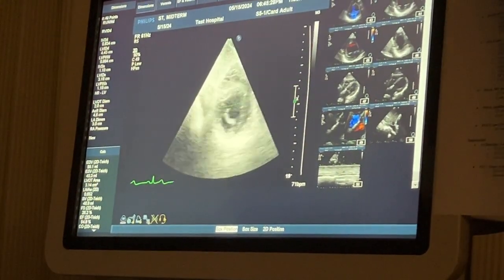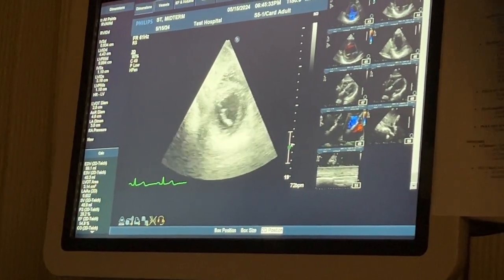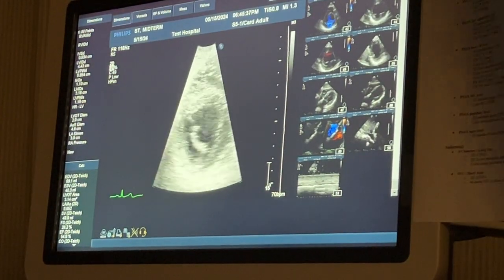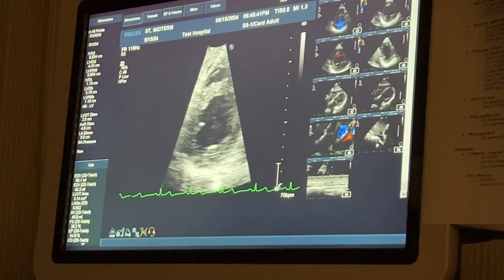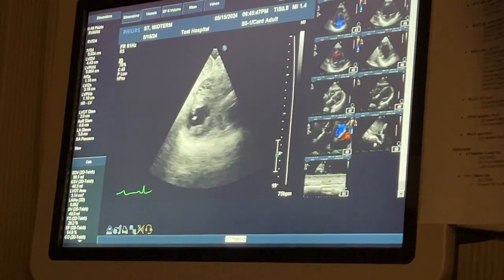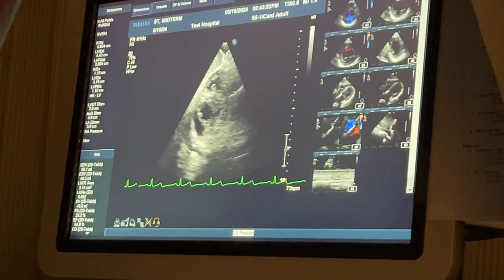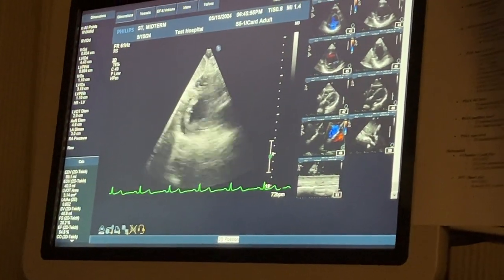And then if you scan down, that's mitral. It's the same movement of your beam scanning down like that. I'm just going to zoom. It's so bright. Mitral. My indicator is pointed just where it is for short axis, so exactly the same place. That looks just like your mitral valve level, but on its side. And then there's your really beautiful LV function shot.